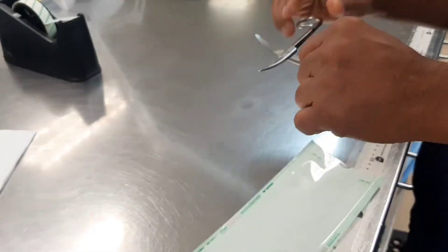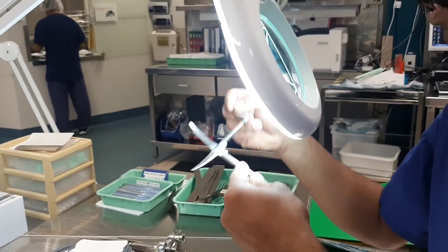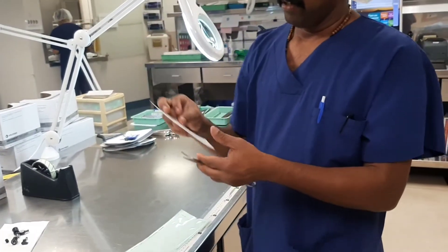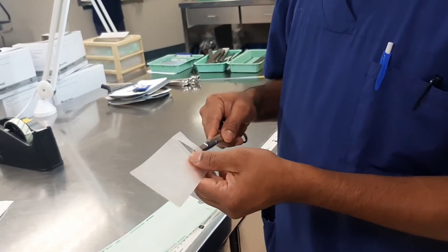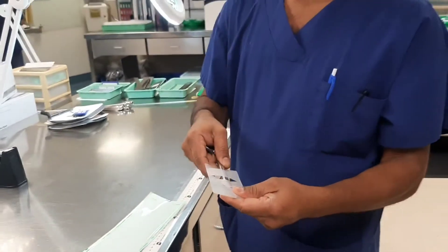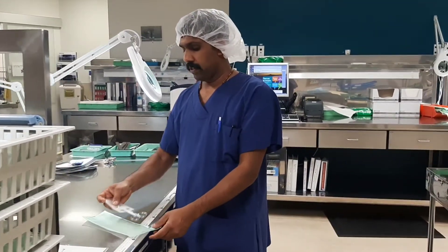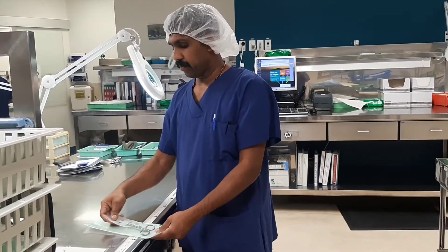Next, I am going to explain how the RMDs are placed in the packaging safely. Sterilization peel pouches are designed for packing small and lightweight instruments. A good rule of thumb: place instruments flat next to each other in a single line. Also, remember to keep the handle of instruments on the opening side of the pouch. Once they are in the pouch, make sure you can place a finger on either side of the pouch.